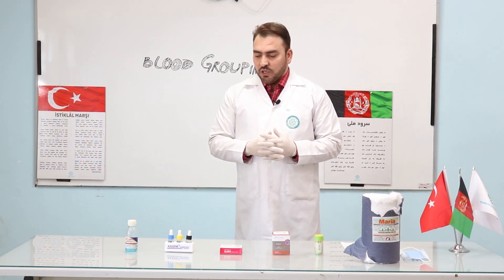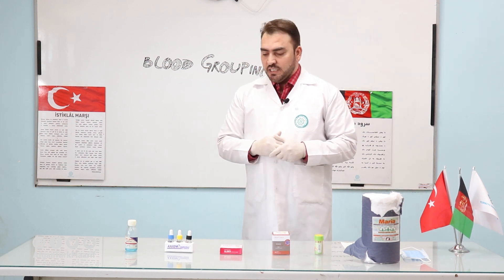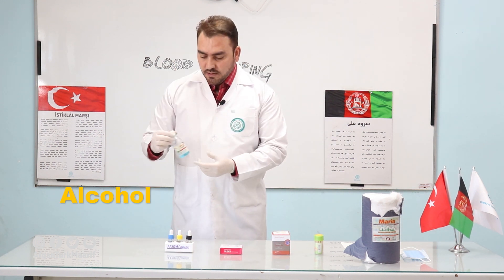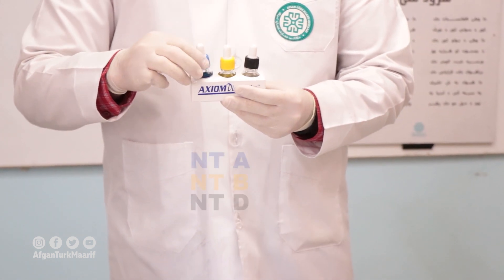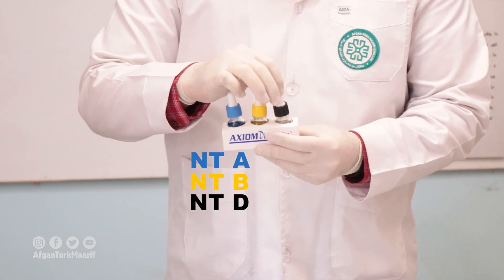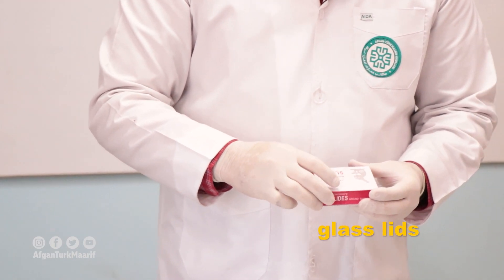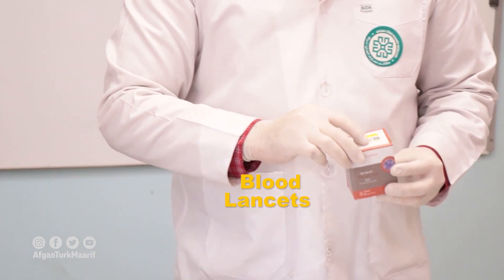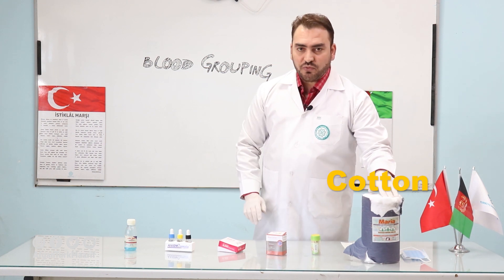Going for the experiment — for this experiment, we need some materials. The first one is alcohol. Then there will be some antibodies: Anti-A, Anti-B, and Anti-D. Then we need some glass slides and also some blood lancets.